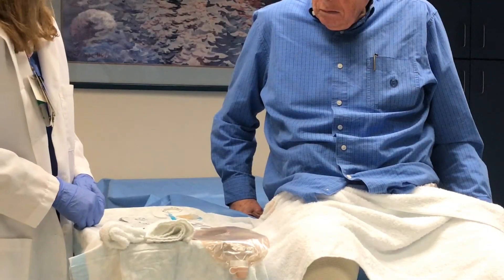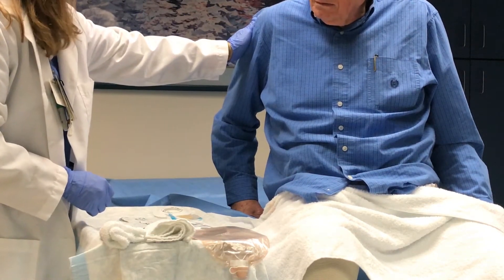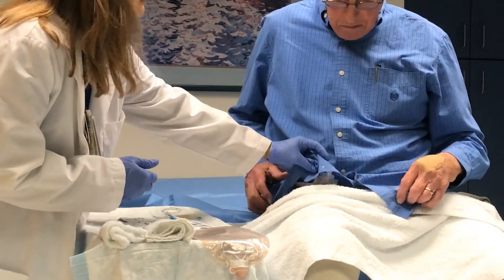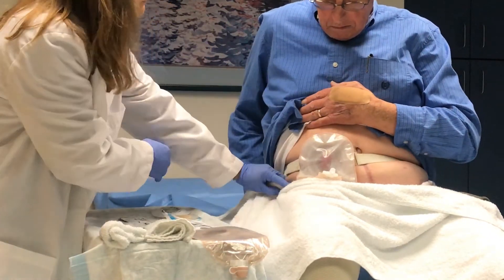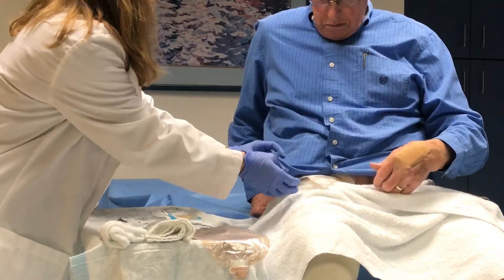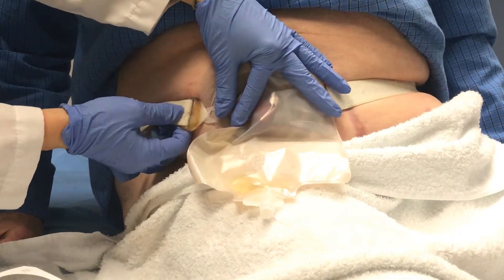This instructional video will go over how to manage your urostomy at home after you leave the hospital. Typically, you would need to change your entire ostomy pouching system every three to five days, or twice a week. You would need to empty the pouch throughout the day. Changing your ostomy pouch may seem intimidating at first, but you will have a specialized nurse called an ostomy nurse, or WOCN, that would teach you how to change and empty your pouch. Let's see how to change your pouch.